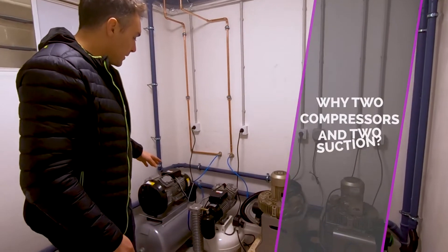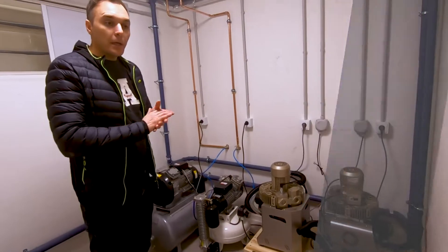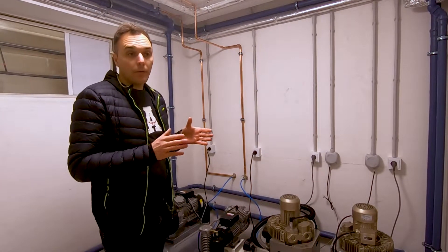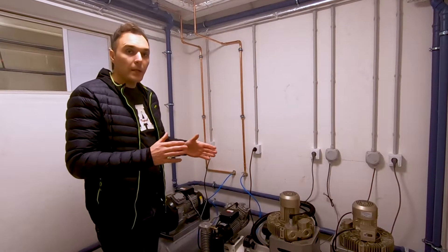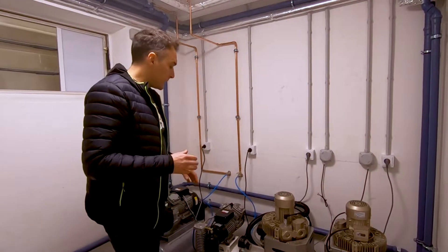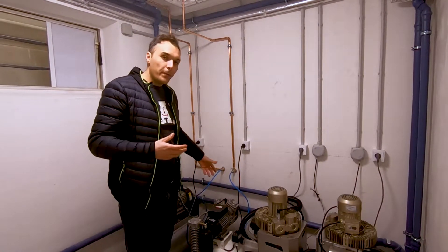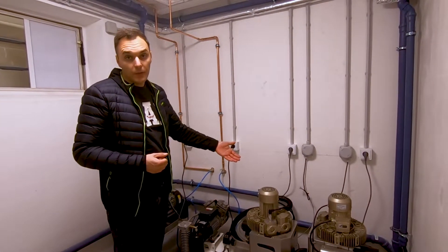We install two compressors and two suctions. In this clinic we have six dental units and we wanted to separate the system: two units work with one compressor and one suction, and the other four work with one compressor and one suction. We didn't place one big compressor and one big suction because in case we have a problem with one compressor we can use the other one and keep working, and the same for the suction system.